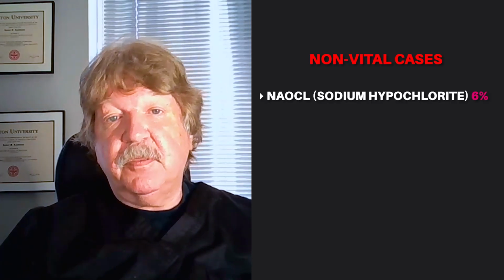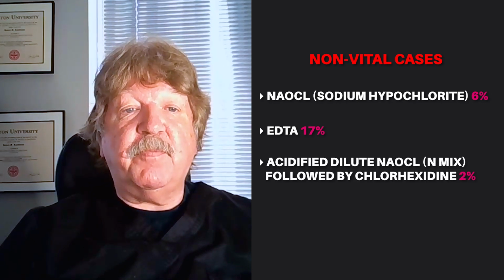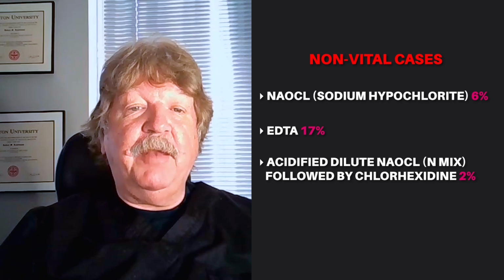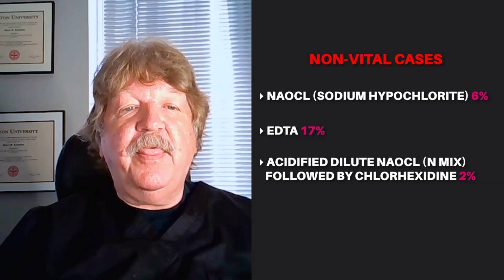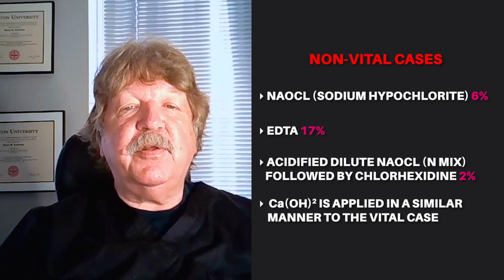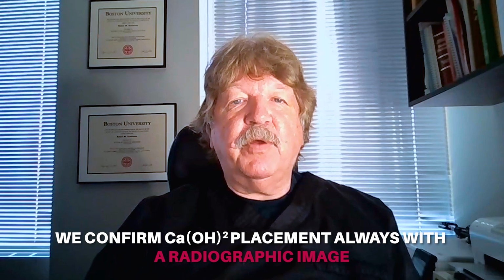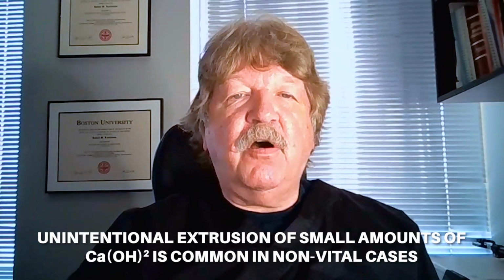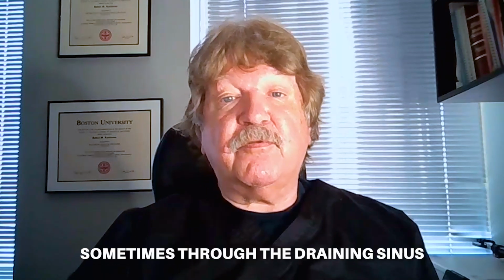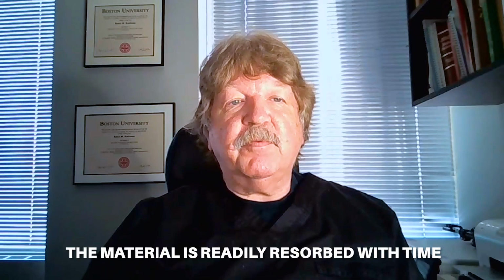For non-vital cases, I use sodium hypochlorite 6%, same EDTA 17%. I then use an acidified dilute sodium hypochlorite, which we called N-mix, that's just the name we gave to it, followed by chlorhexidine 2%, and then calcium hydroxide applied similarly to the vital case. We confirm calcium hydroxide placement always with a radiographic image. Unintentional extrusion of small amounts of calcium hydroxide is common in non-vital cases, sometimes through the draining sinus. This shouldn't be of concern, and the material is readily resorbed with time.